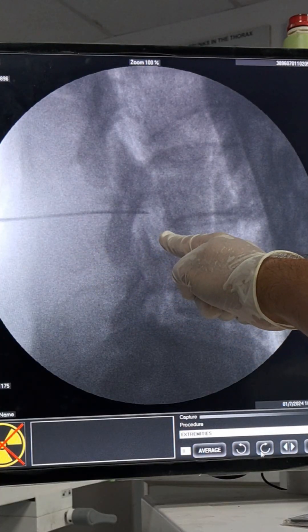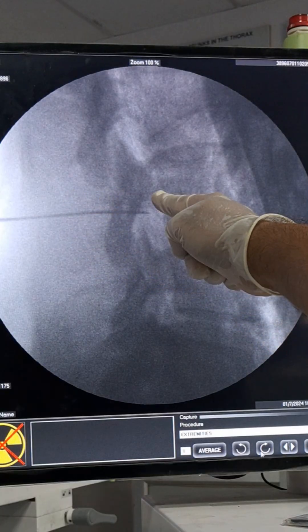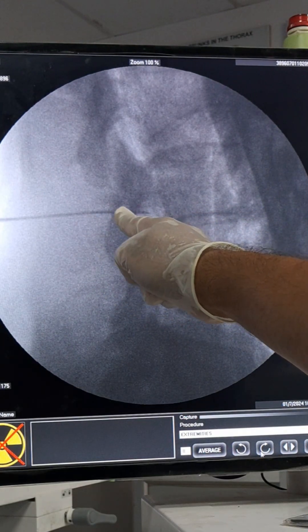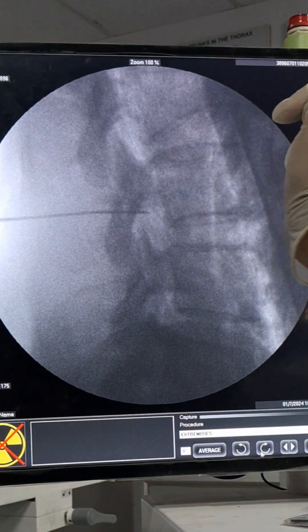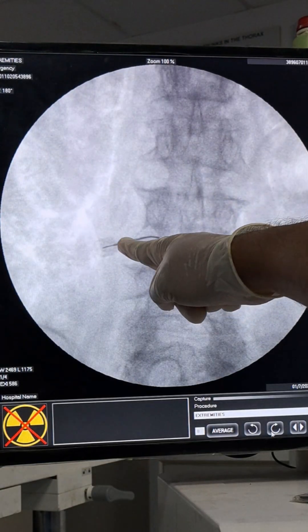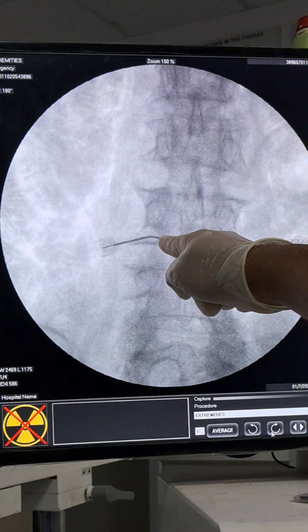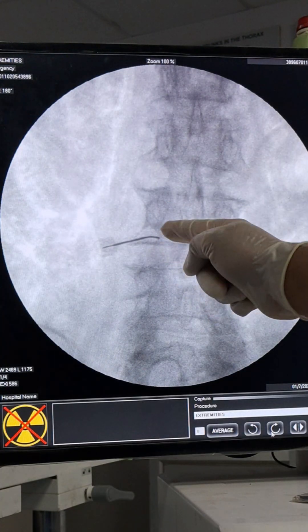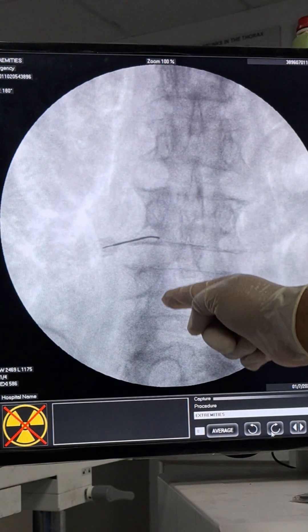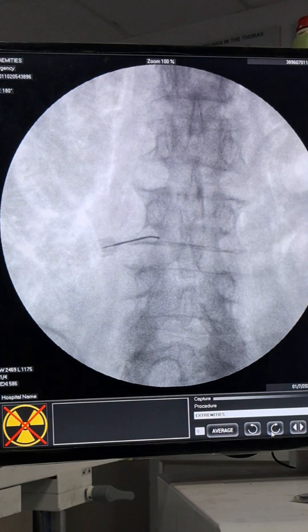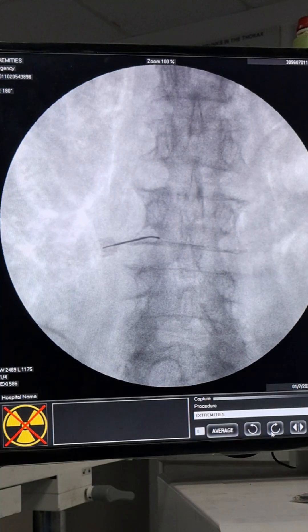For Kambin's triangle approach for transforaminal epidural, the needle comes in toward the epidural space. For subpedicular transforaminal epidural the needle will be here, and for the pars approach the needle is pushed just through the foramen — you cannot take the needle further ahead or it will puncture the dorsal root ganglion. In AP view you can see the needle has come from lateral to medial into the foramen, almost at the medial pedicular line just crossing the pars. This is the final position for dorsal ganglion RF. Stimulation is done next — if sensory stimulation is satisfactory, we proceed with pulse radiofrequency.